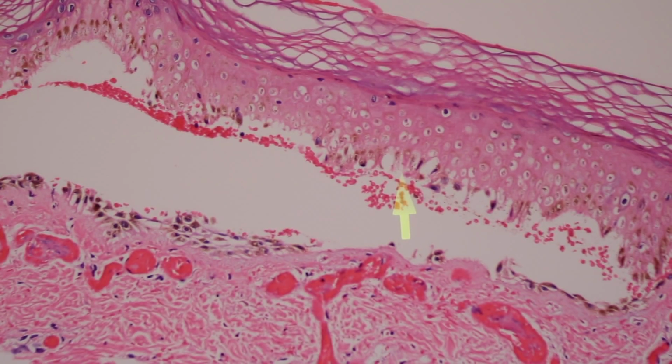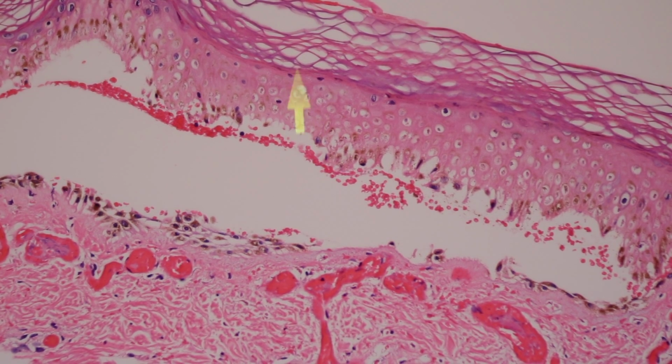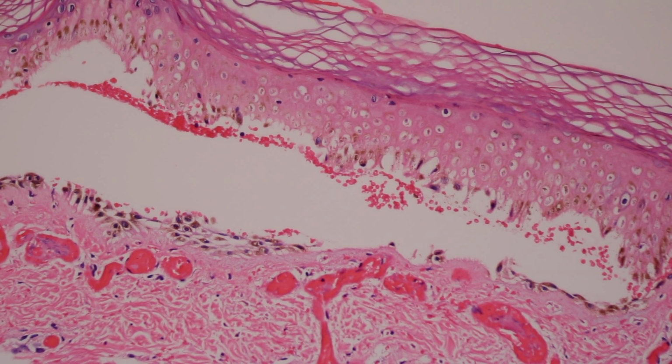The nuclei of the keratinocytes, they're still there, but they're not purple anymore, because as cells die and their nuclear membranes open up, the first thing to get broken down really is the DNA and the nucleic acids in the nucleus. And that's what makes the nucleus look purple on the H&E stain. The nucleic acids pick up the basic hematoxylin stain. The cytoplasm looks pink because it's filled with keratin filaments, as we talked about in my normal skin histology video. And if you look up above right now, you'll see a little link pop up, and you can go watch that video right there if you want to get an update on normal skin histology.